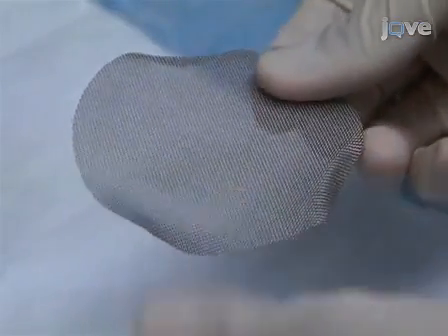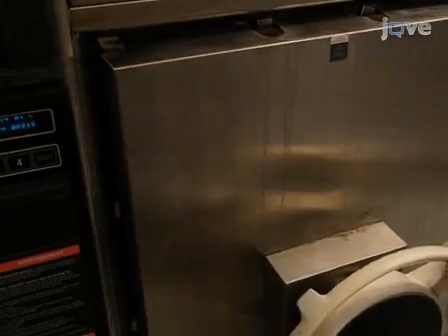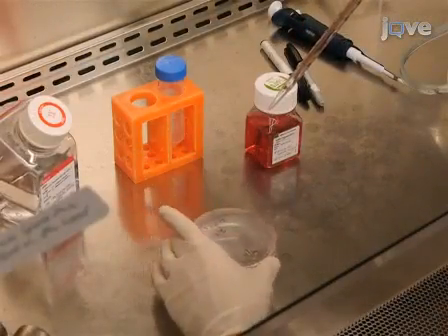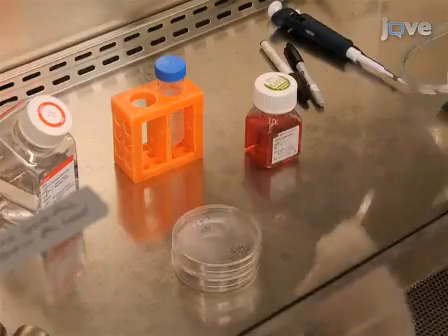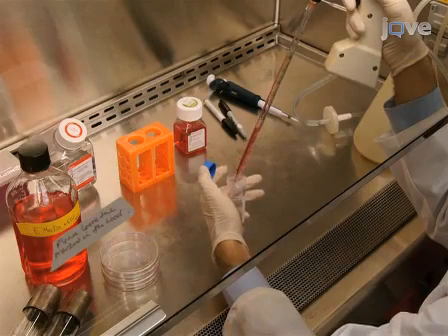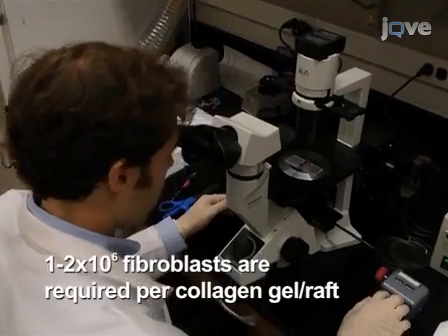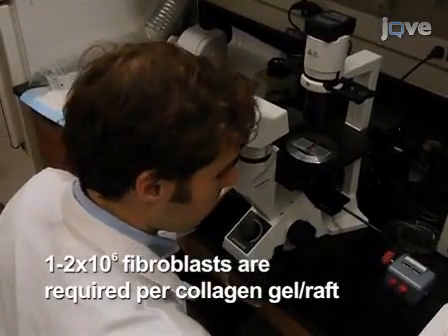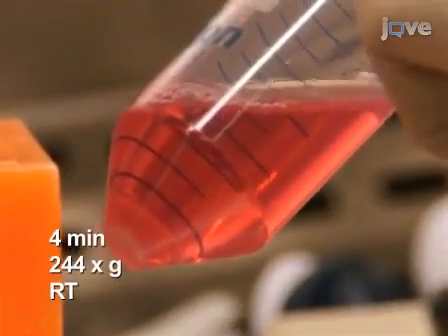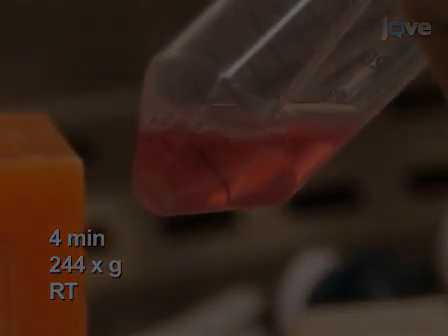Bend three sides of the raft about 0.5 centimeters at equal distance from each other, then autoclave the raft grids. After preparing the collagen gel, trypsinize the J2 fibroblasts and neutralize the trypsin with medium. Transfer the fibroblasts into a 50 milliliter conical vial and count the cells to determine the number of rafts that can be made. After spinning down the cells for four minutes at 244 times G at room temperature, aspirate the medium.